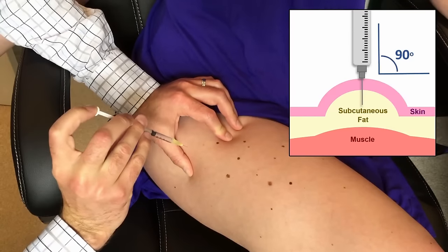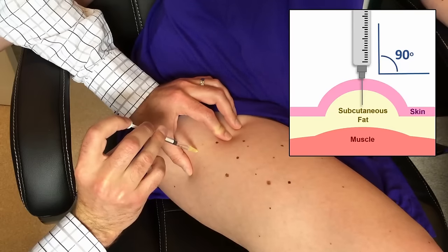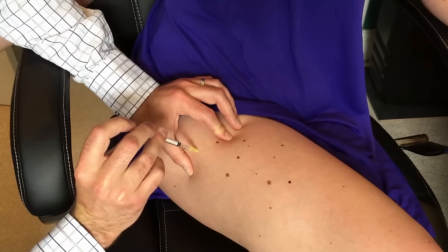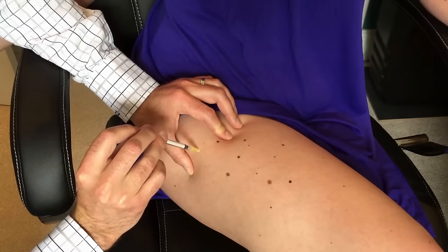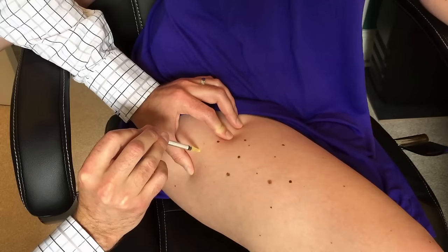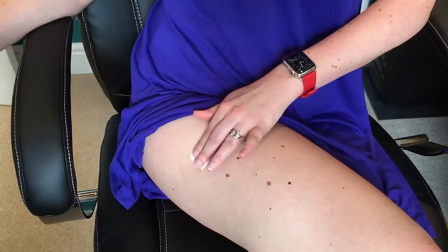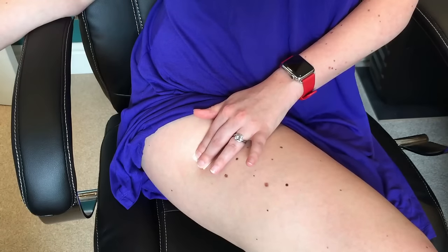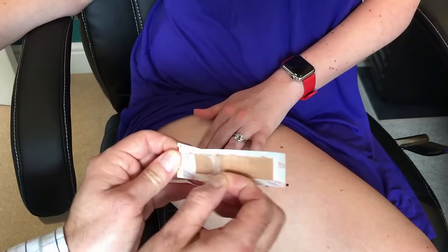Hold the syringe roughly 90 degrees to the skin and push the needle firmly into the tissue. The needle is short so don't worry that it is going too deep. Once the needle is in, try not to move it around as this is what can cause discomfort. Gently push the plunger down, injecting all of the fluid into the leg. Once all the fluid has been injected, pull the needle straight out and take a piece of cotton wool or an alcohol swab and put some pressure over the injection site. It can be perfectly normal for a bit of the fluid to come to the skin surface or a little bit of blood. Continue to put pressure on the site until any light bleeding has stopped, or alternatively you can put a plaster on the area.